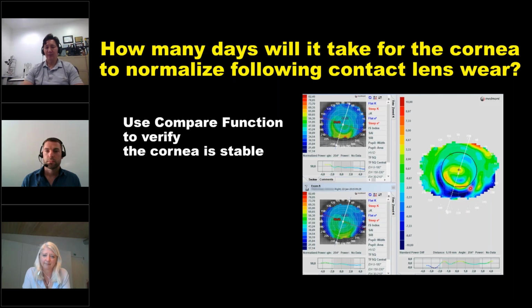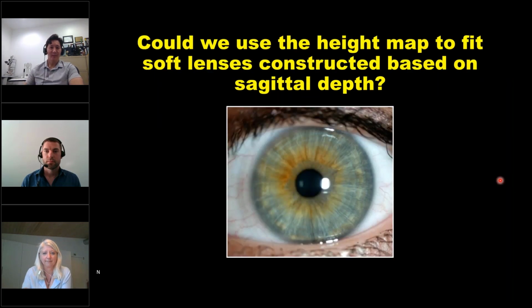And in both those cases, it took 8 months for the one sister and 11 months for the other sister before the eye took on a normal shape and before we were seeing green on the subtractive map between visits. So that was a long time, almost a year for those eyes to normalize. And I think as the group is communicating, it's really difficult to say from one patient to the next the length of time that it's going to be for normalization. It's really hard to define.